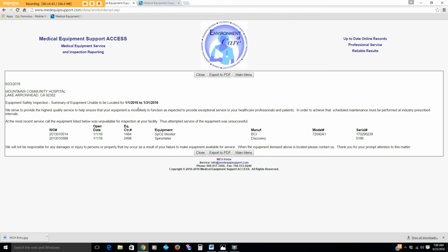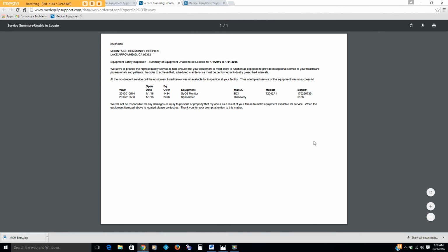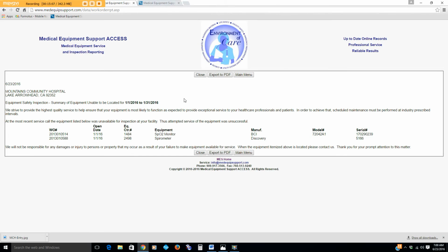That would be given to the departments, and hopefully, even though I know the nurses are busy, they should be able to locate the equipment because they're the ones that have the hands-on with this device. Visiting biomeds checking through closets and stuff like that kind of makes the nurses a little cautious. Better to ask. And also that way you don't need to explain to biomeds why you didn't find the equipment or didn't ask.